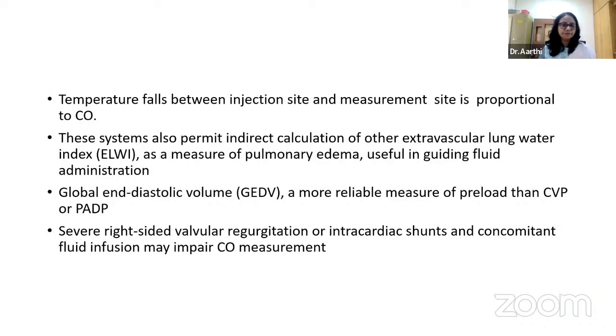All these thermodilution techniques also provide us with various other parameters to assess the hemodynamic status of the patient. Temperature falls between the injection site and the measured site proportional to the cardiac output. These systems also permit indirect calculation of what is called the extravascular lung water index as a measure of pulmonary edema, which is helpful in guiding fluid administration.